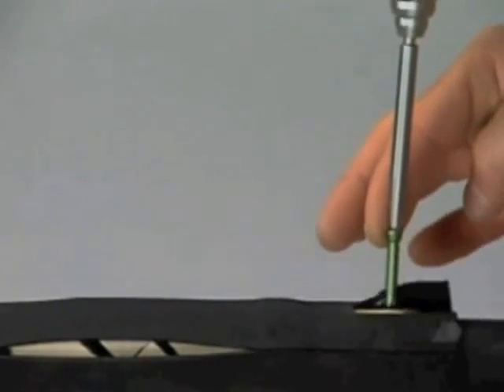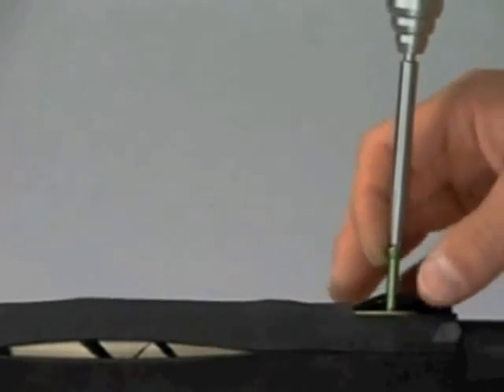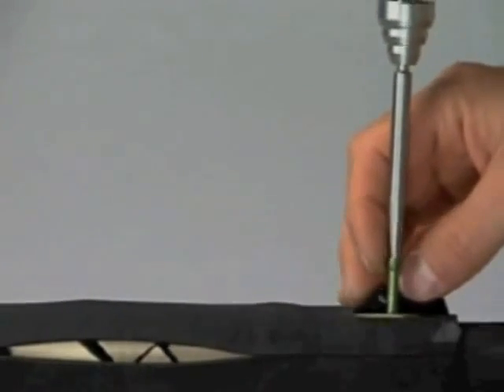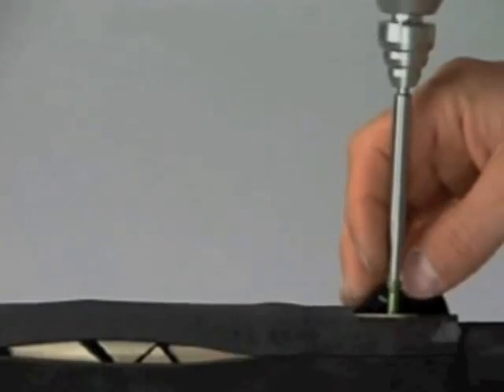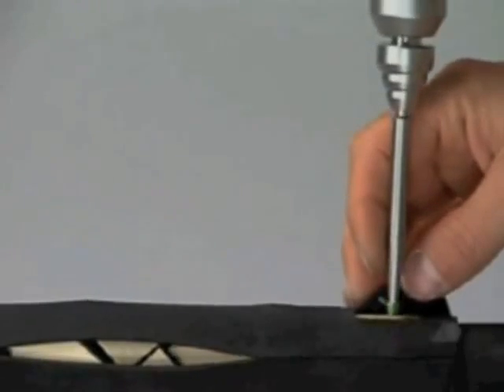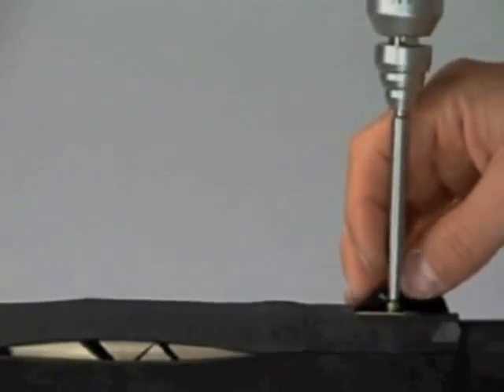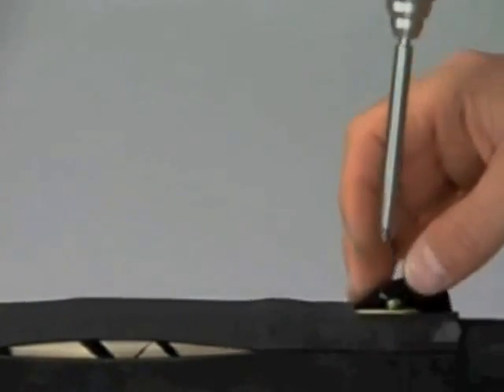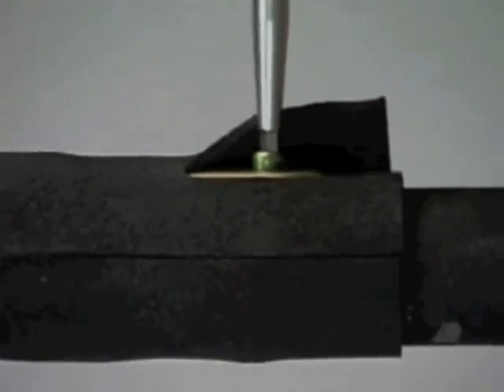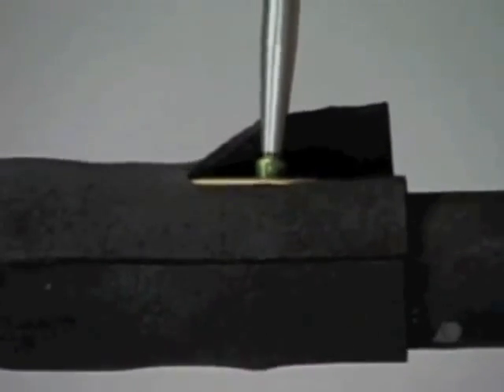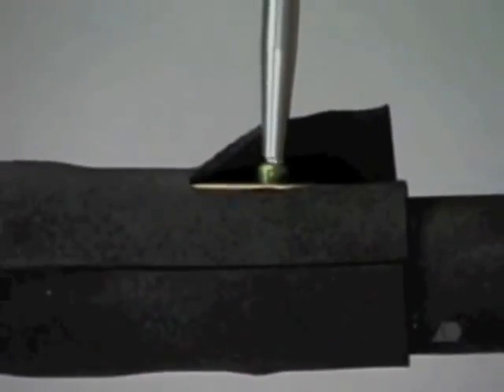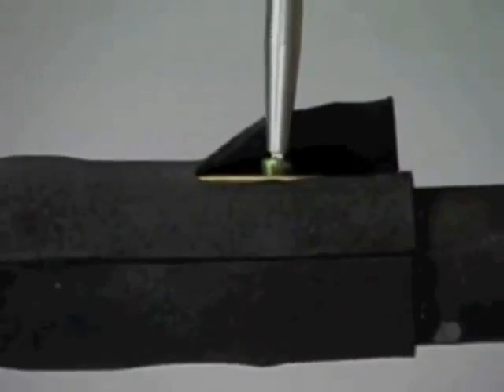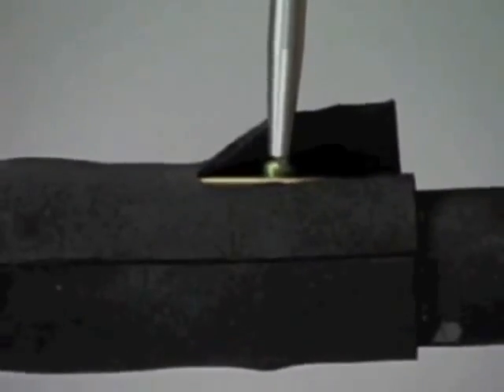A green, self-tapping locking head screw is inserted with the power drill. Although the last few turns must be done by hand with the torque limiting screwdriver in order to prevent over-tightening.